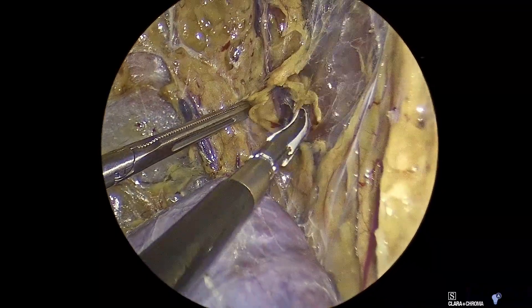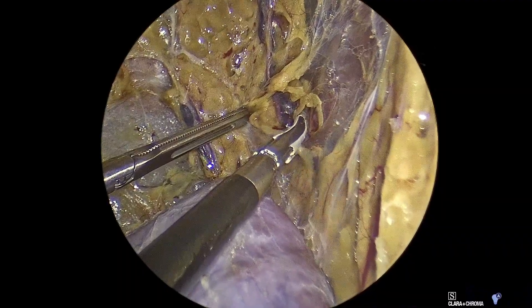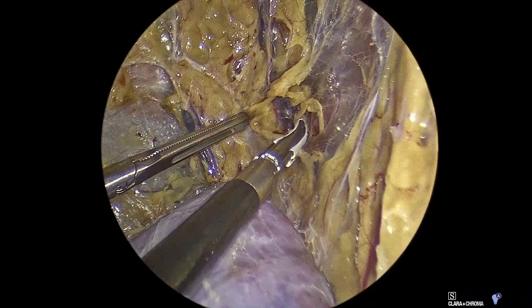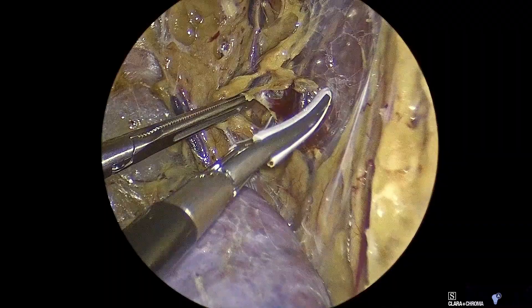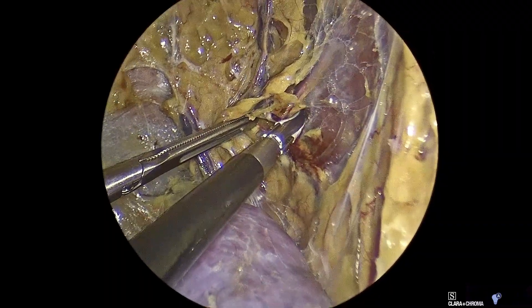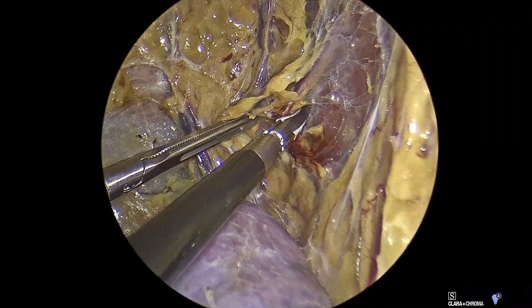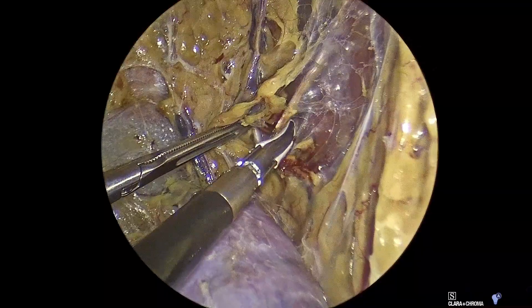The left adrenal vein is isolated, ligated, and divided to prevent any bleeding. There is limited or no bleeding, as you can see.